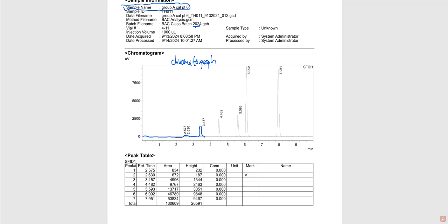So the higher this peak is, what we call that, the higher the peak, the more stuff that is present. So we are going to call this a peak. And there's mainly 1, 2, 3, 4, 5 major peaks that I see here very easily. 5 different ones are here. And each one of those peaks is going to come from a component that we have added into that series of standards that we made. So let's keep in mind what was in there.